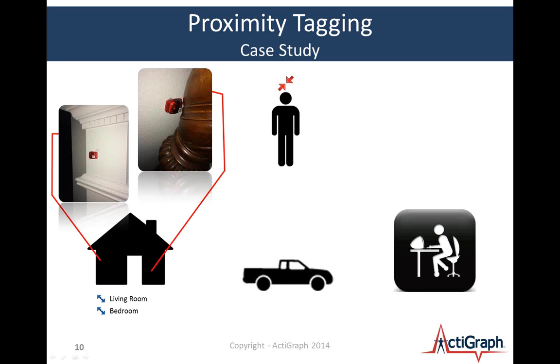Okay, I had another question. Are there plans to enable one device to act as both a beacon and a receiver? From Jason asking that question. He comments also that currently the only way to detect proximity of people from each other is to have subjects wear two devices. Yeah, Jason, that's a great question.